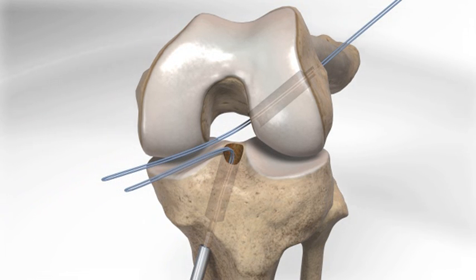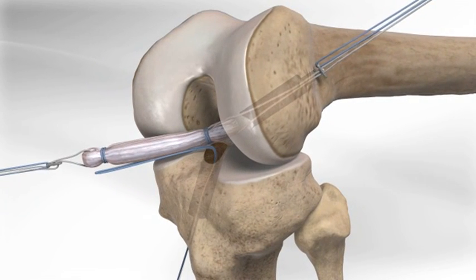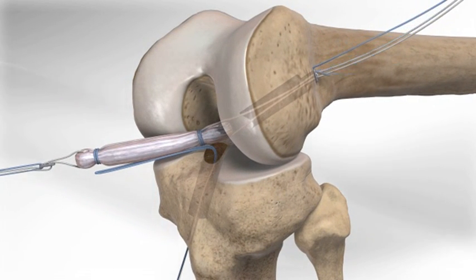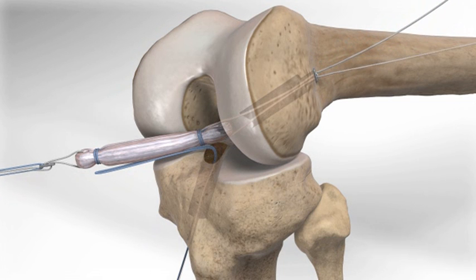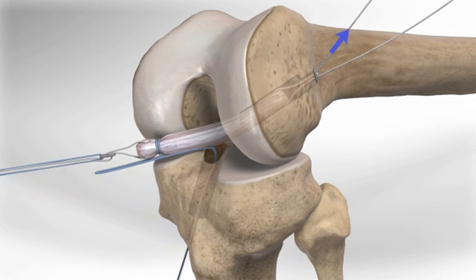The femoral suture is then used to pass the GraftLink construct, which consists of two tightrope implants and a single graft sewn into a loop or link. The femoral tightrope implant is passed until the button exits the bone and is fixated against the femur. The surgeon then pulls the white sutures, which hoists the graft into the femoral socket for an exact fit.